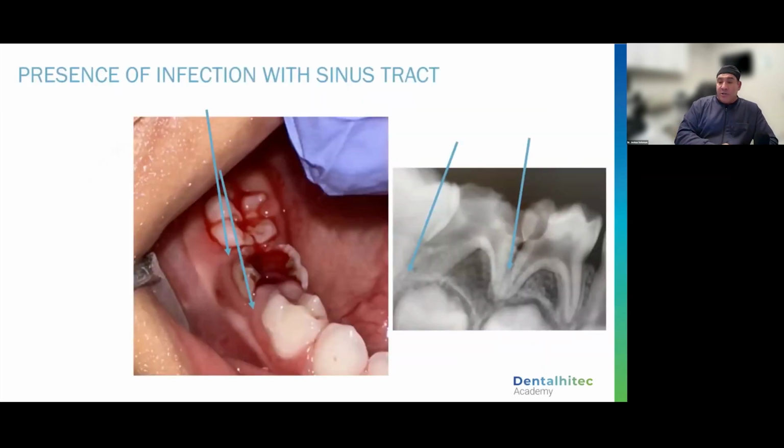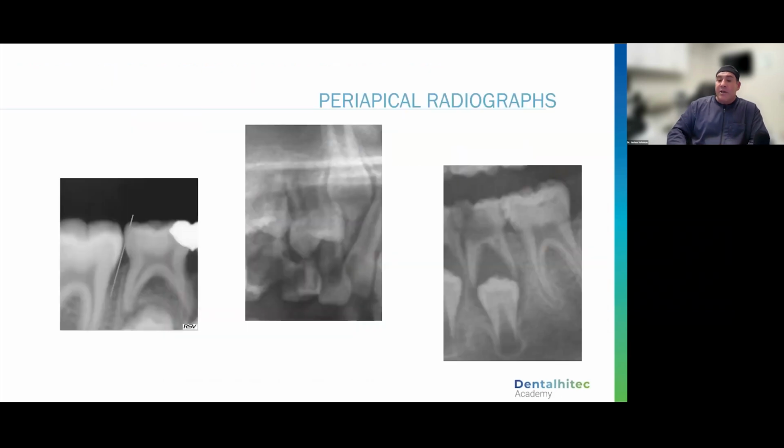If you have a sinus tract like this, you may need to give your local anesthetic on the lingual aspect there, on the palatal aspect. If you have large infection in an area, I may give it in 2 different sites and split it up. It's absolutely fine. But if you notice, where you have periradicular lucency or an apical lucency at the furcation, that's not organized bone, and it is sometimes harder to get numb in those areas. So you may need to pick an alternate site.